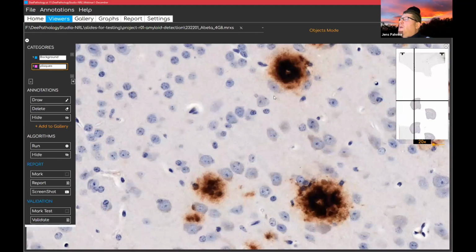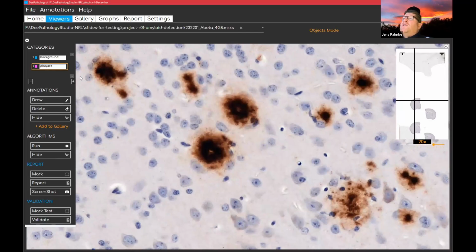So I go in here and have a look for a location that I like. Then I draw for the machine a learning model, so it can now detect: this is one of my plaques.